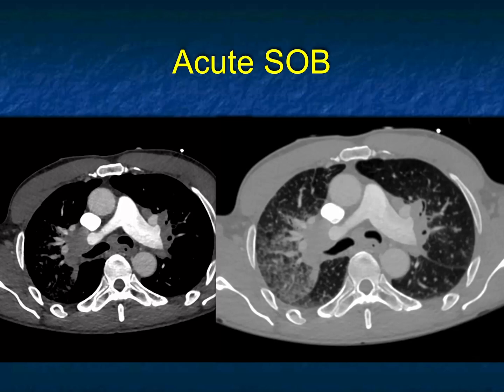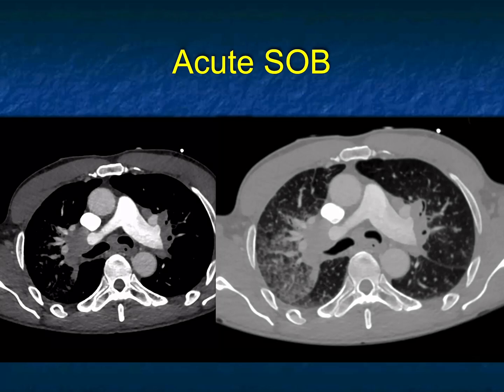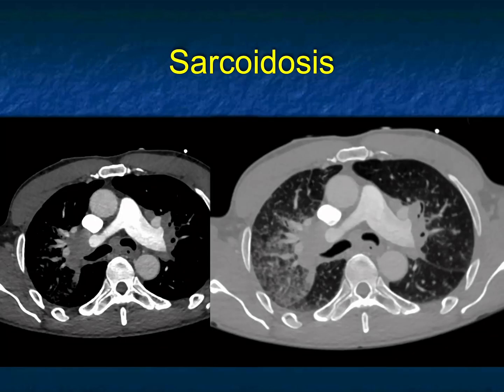This patient has acute shortness of breath. I see adenopathy in the hilar regions, right greater than left, and infiltrates in the lung, greater on the right side. It's coming from the hilar region. You'd have to consider lymphoma with adenopathy and lymphangitic spread along the vessels in the right mid-lung. But there are also inflammatory etiologies. It's not the typical appearance of TB, but it's a very good appearance for sarcoidosis — lymphatic-type spread extending from the hilum, hilar adenopathy, subcarinal zones. A very good diagnosis of sarcoidosis.